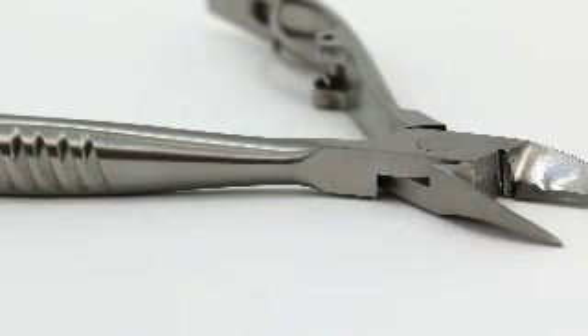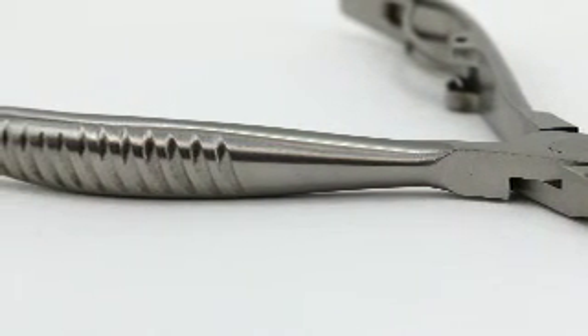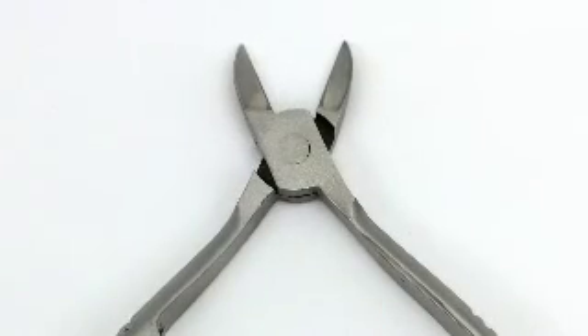The ClipPro Nail Nipper KP700 is made from high quality stainless steel. This nipper is an exceptional tool to cut thick toenails because its blades can be opened wider than one inch. This is particularly useful for those whose nails are impacted by diabetes or fungus, which can cause nails to be thicker beyond regular nails.